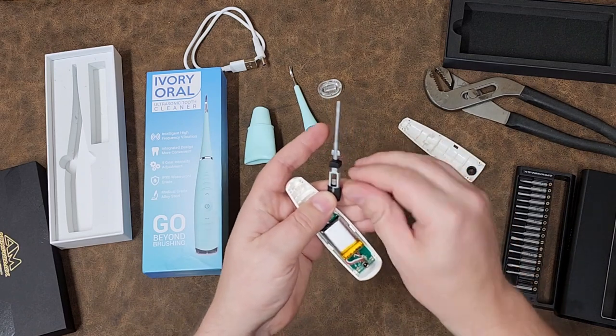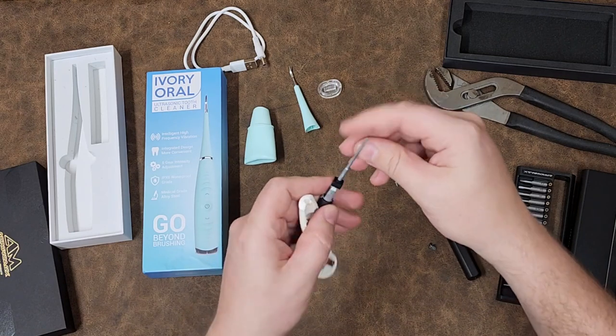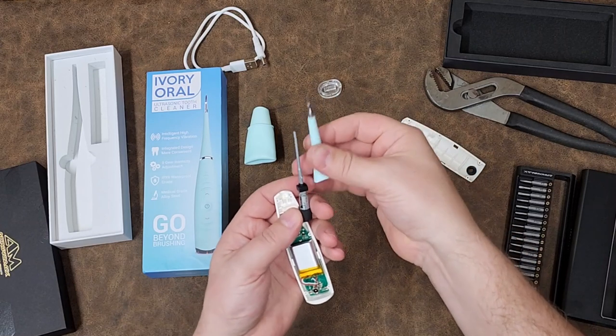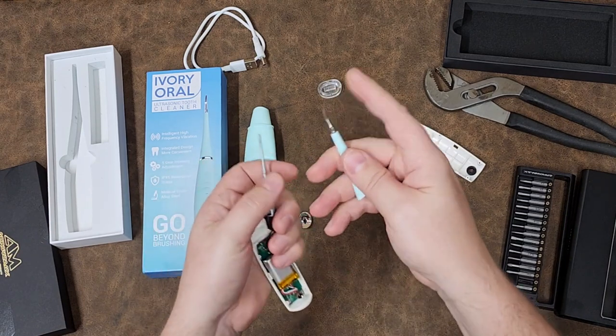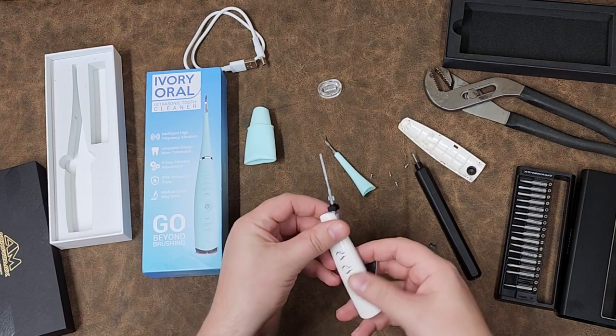All it's doing is vibrating the motor, which is encased in a very soft pop metal dinglehopper that goes up inside — though it doesn't even go up inside all that far. It kind of stops at the base of the stainless steel pick. That's it. It's very simple.